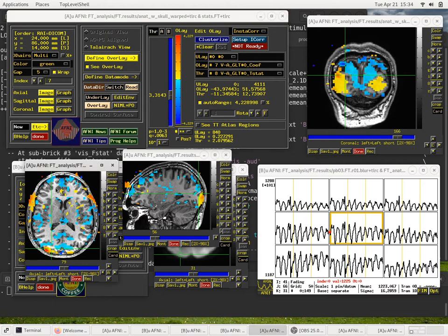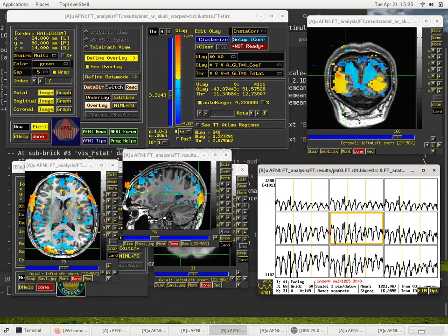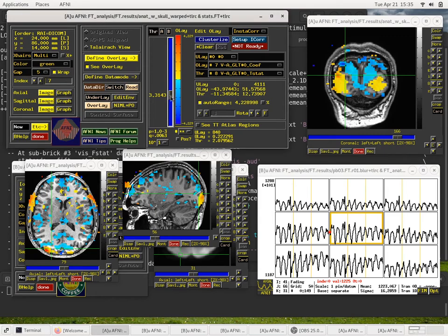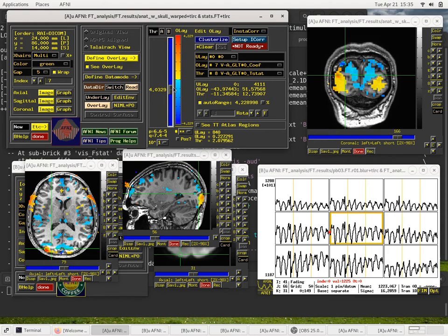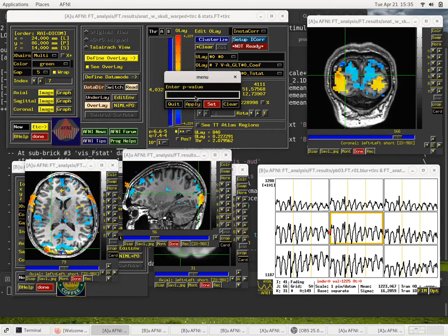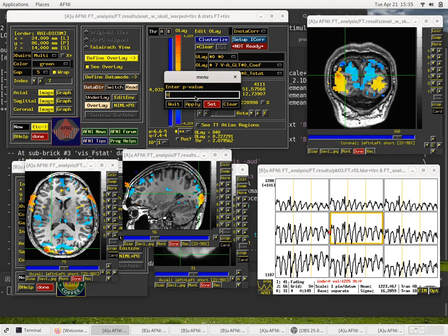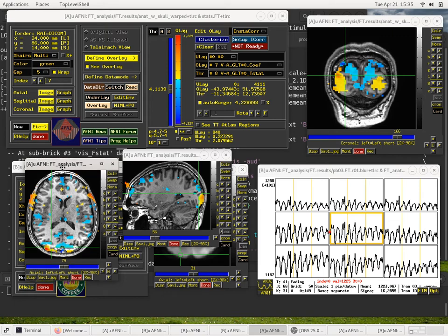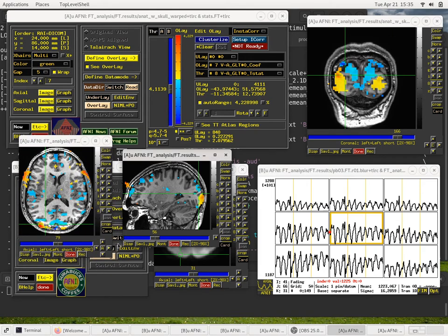But 0.001 is maybe a little too lenient here because the results are strong. Again, as you see in the time series, there's a very clear effect from these tasks when compared to fixation crosshair. So the statistics are pretty strong. So we might drag it up a little bit more. That's absolutely perfect, 4.032. Or we can even type in a p-value. We're at 10 to the negative fifth here, so let's set it to 4.7 times 10 to the negative fifth. Clearly that's what we should be using.